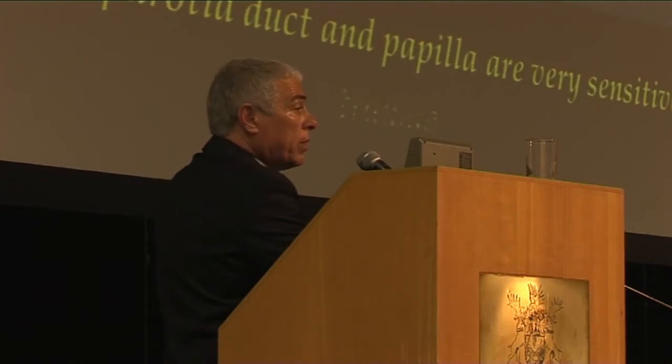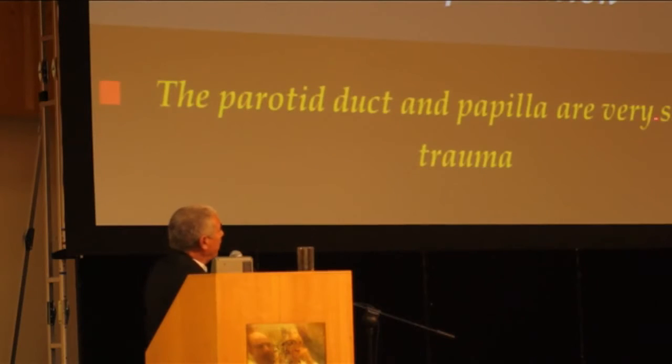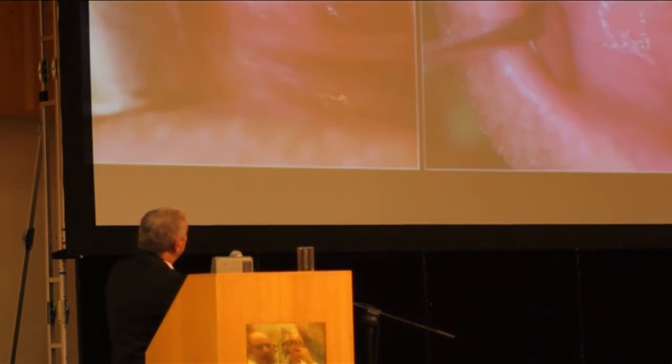And what is most important in parotid surgery, the parotid duct and papilla are very sensitive to trauma. And this is the reason we need, after every surgical procedure, to insert a stent. And this is a stent that we use.